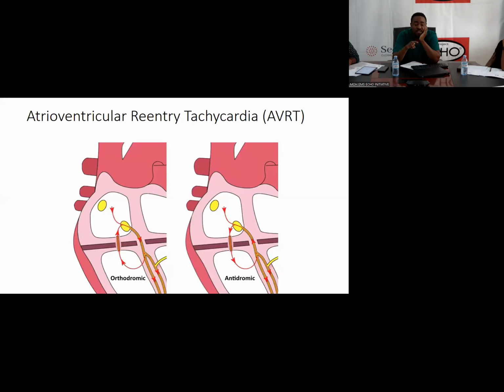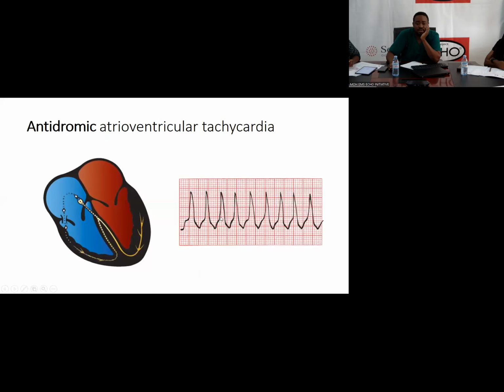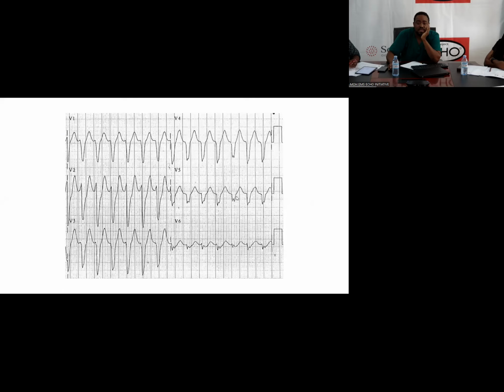So it can take two forms, either the orthodromic or the antidromic, but the characteristic ECG appearance will be a very fast heart rate with a wave that's abnormal, called a delta wave. So instead of the ECG appearing with a normal QRS, you see a rhythm that's very rapid and a QRS complex that's a bit wide and having a wave before the QRS. So this is how it would typically look. Wide, but then before the QRS, you see a wave before.